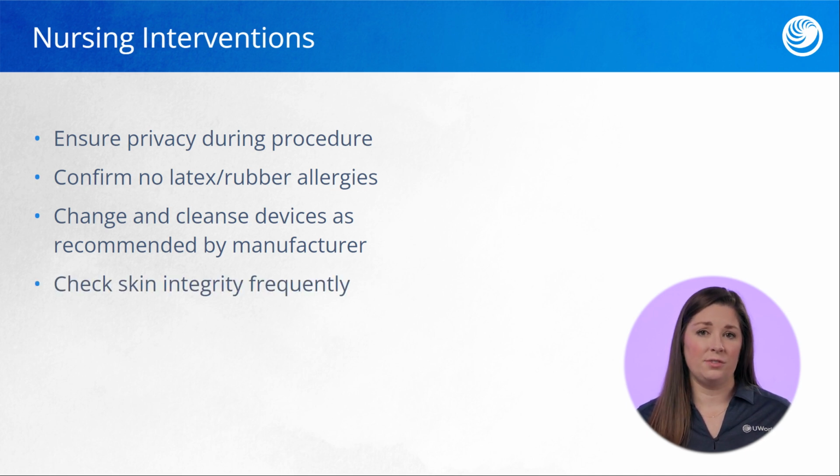Checking skin integrity frequently is extremely important. Remember, the higher amount of moisture present, the higher likelihood that there will be skin breakdown. So checking this frequently can help prevent any type of wounds or breakdown in the skin.